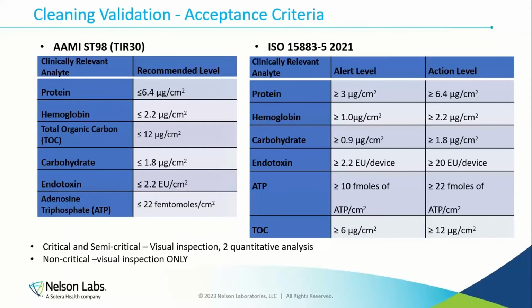These are some of the acceptance criteria that are specified in AAMI ST98 and then ISO 15883 as well. Just to give you an outlook of the acceptance criteria of the analytical tests that are performed, they are very close. They're exactly the same as ISO 15883, but they're just alert and action levels.